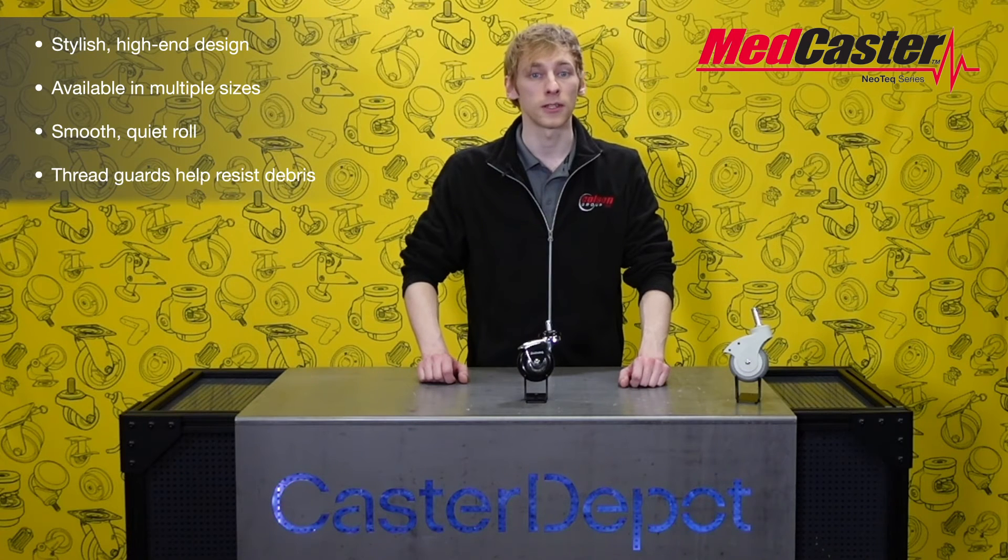Here we have an example of MedCaster's Neotec series. Neotec casters offer a stylish high-end design and they are available with two, two-and-a-half, or three-inch wheel sizes. Neoprene wheels provide a smooth, quiet roll. Chrome thread guards prevent debris from collecting around the bearing and axle. Neotec casters are rated to support up to 175 pounds per caster.